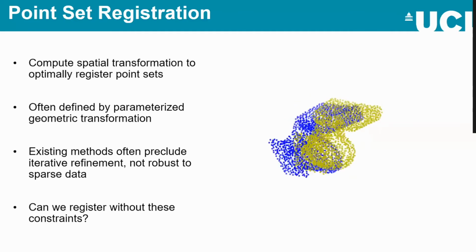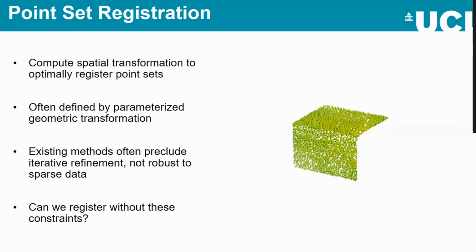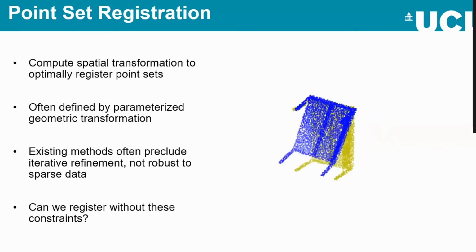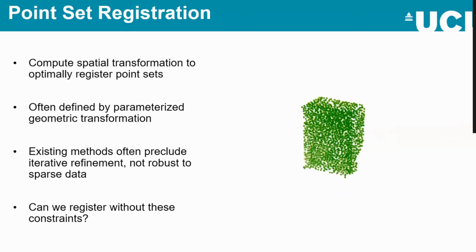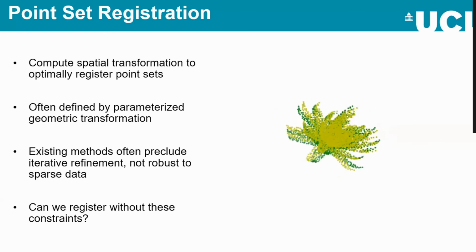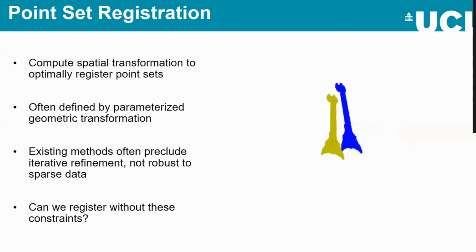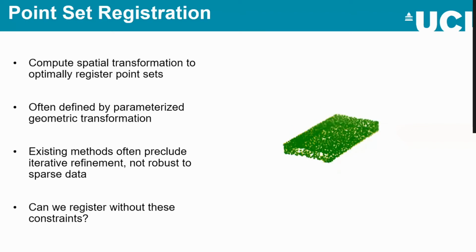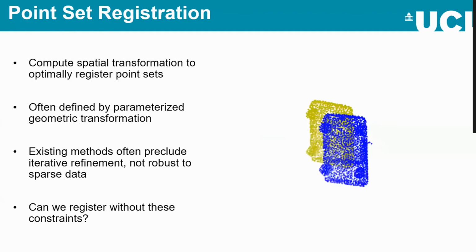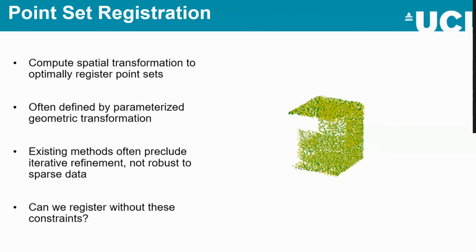Can we construct some sort of learning-based approach, which doesn't require any iterative refinement and can give us a one-shot registration that we could then apply to these images? So in our case, we want to use some sort of learning-based point set registration method on the 3D point sets that are taken from automatic, well-validated learning-based MRI and ultrasound segmentation tools, that we could then use to do some form of rapid registration on the fly using potentially very sparse data, to avoid needing an entire 3D ultrasound volume in the operating room.